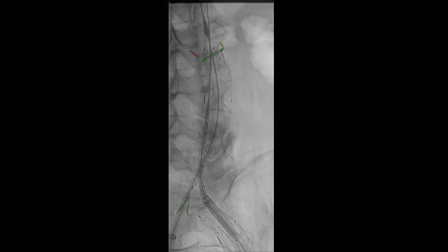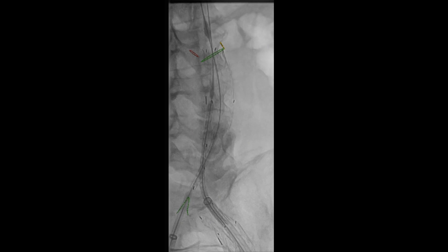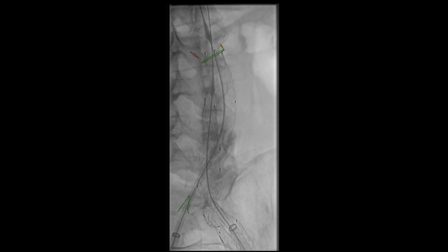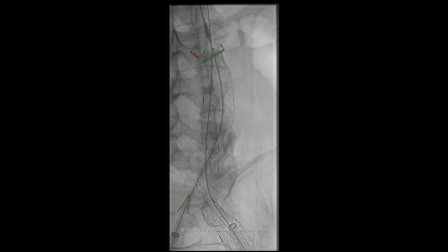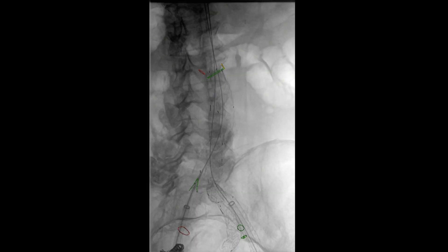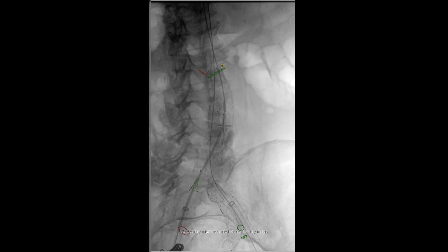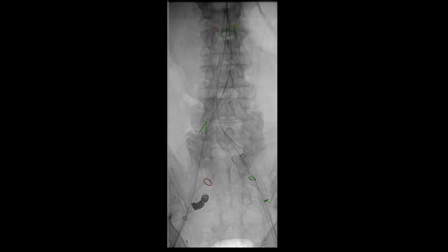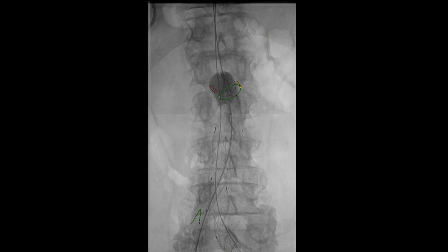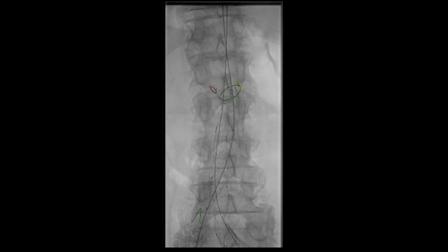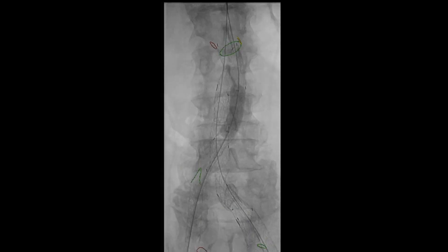A contralateral limb is then brought into place and used as a bridge between the main endograft and the iliac branch device. This limb is then deployed. This is followed by deployment of the main body and extension of the ipsilateral limb using an extension limb, which is then deployed. We then proceed with balloon angioplasty at the aortic neck and areas of overlap to ensure adequate seal of the endograft and iliac branch device to the arterial wall.